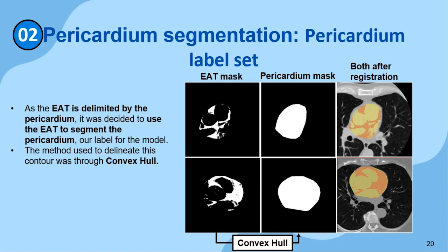Then the farthest point from the line formed by these 2 points is selected in order to form a triangle, and all points that are within this triangle cannot be part of the convex hull. This process is repeated for the triangle lines and so on until no point is left and the convex hull is bounded. The result is presented in the image below.